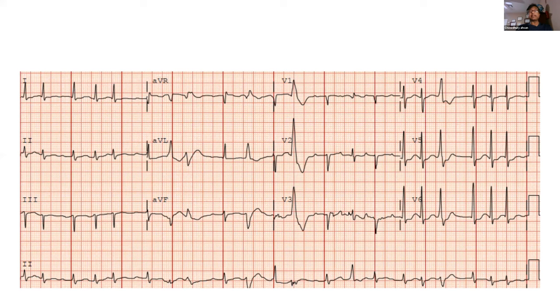So any comment on this EKG? Because there will be more to come. Well, the heart has not decided which way it will go. All sorts of arrhythmia. So we read it as AFib and then PVC. Yeah. And then this happened overnight.